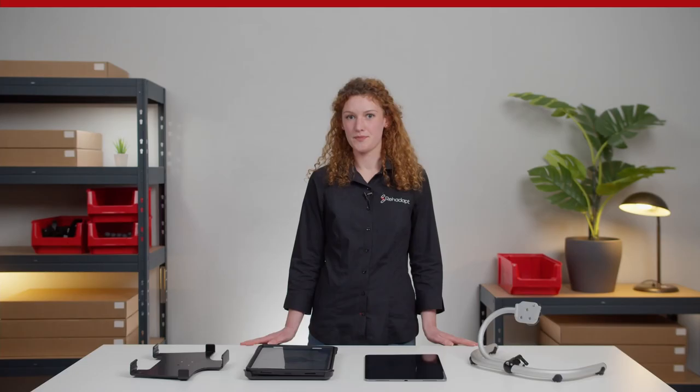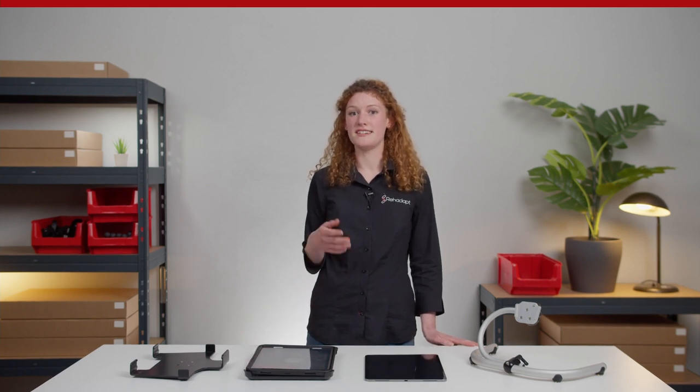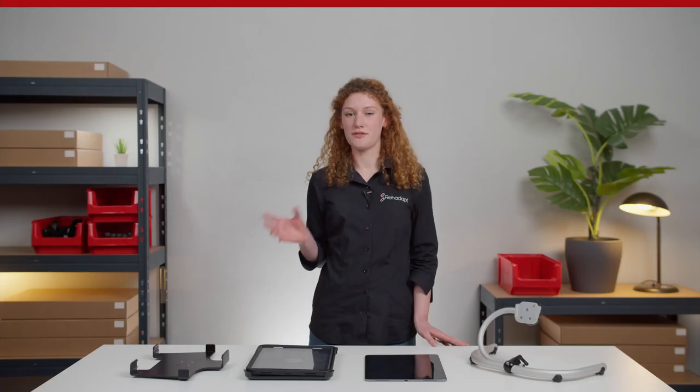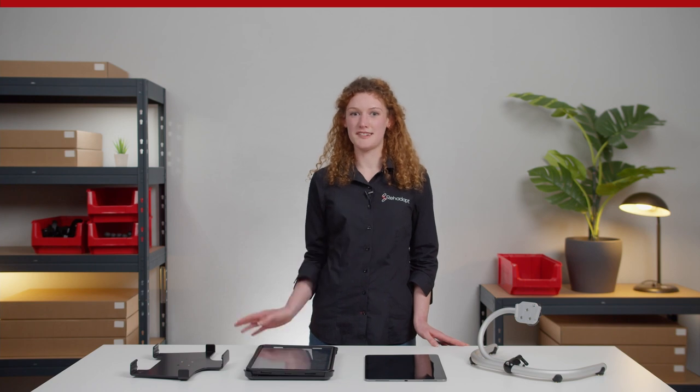Many of our customers use standard electronic systems, for instance iPads, in addition to or instead of their dedicated AAC device. For the safe positioning and also connection of those devices, Rehadapt offers a wide range of adapters that fit onto any kind of tablet device.